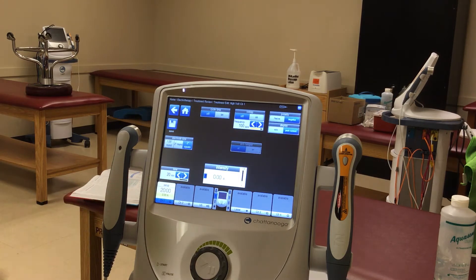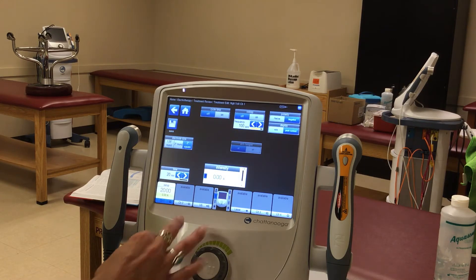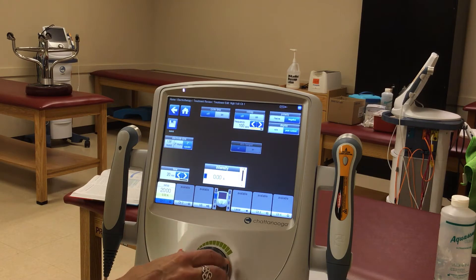For treatment time, 20 minutes is okay — I'd say 15 to 20 minutes is probably best, depending on what kind of injury you're treating. If you are working on edema, it might be a good idea to go longer, closer to 30 minutes, but for wound care 20 minutes is probably sufficient. From there you would just start turning the current up.